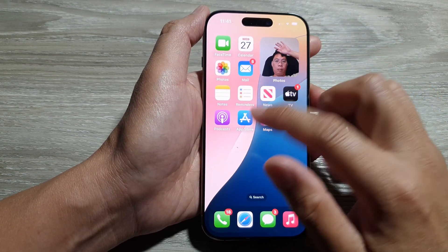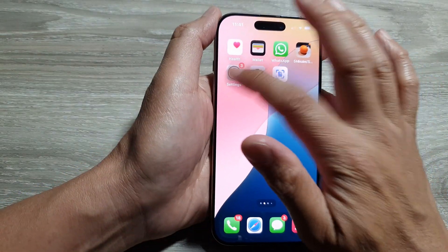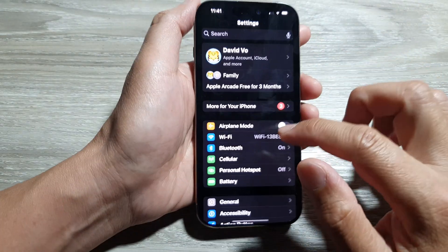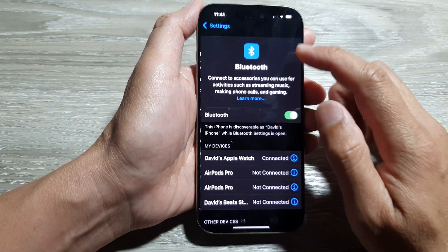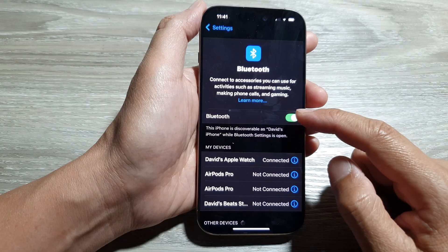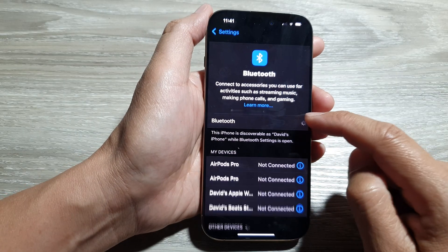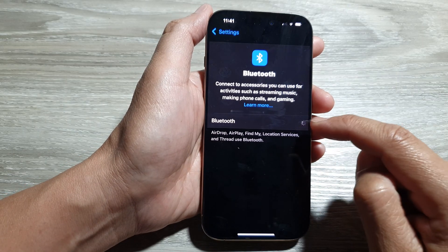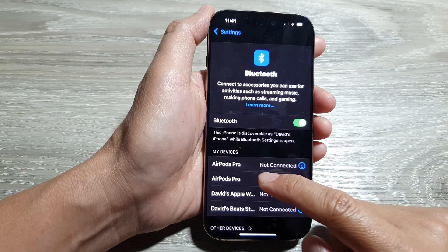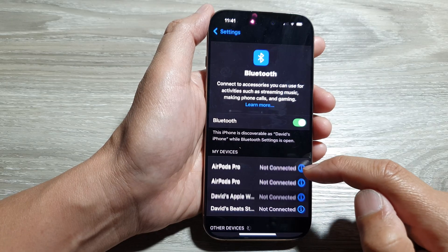You also want to check and make sure Bluetooth is turned on. If Bluetooth is switched off, your AirPods may not work. So make sure you turn on Bluetooth and also make sure your AirPods are connected.